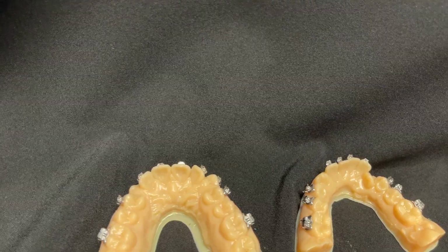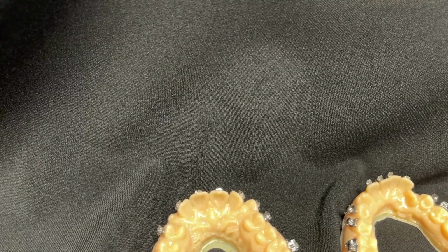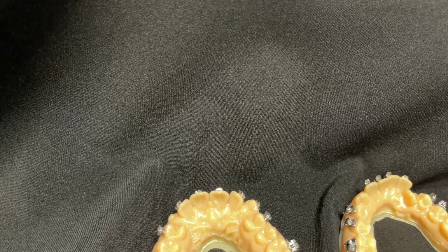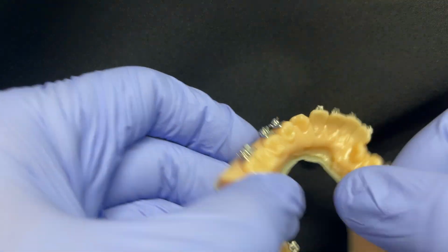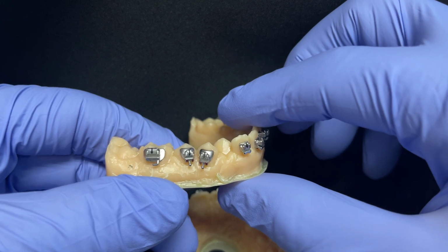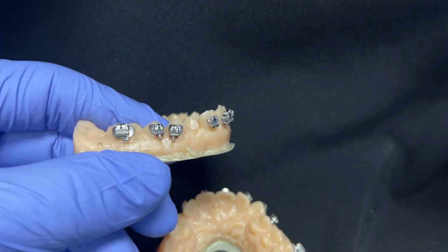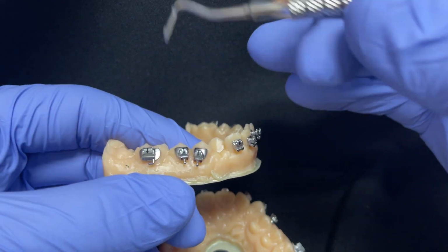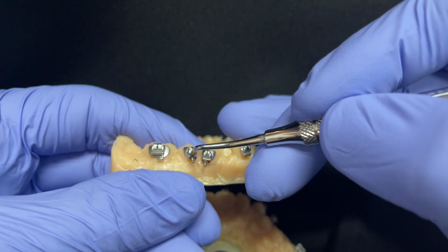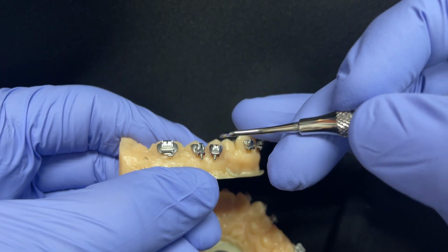And out of habit I usually start with the lower arch. So we're going to pick up this lower arch here, and we're just going to simply see what we have. As mentioned before, our lower fives are typically our rate limiting step, if you will. So I like to try to get those as gingival as I can get them.